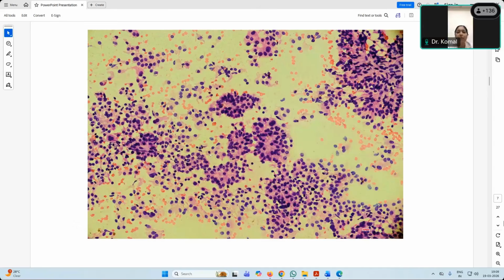Ma'am, I was thinking of papillary thyroid carcinoma. Okay. So do you find those, maybe a little bit of overlapping is there, but did you find other nuclear features to support that? Ma'am, I did not appreciate pale powdery chromatin here, but in some there was some visible nucleoli, as you also said. And also we need to see the nuclear grooving and intranuclear pseudo inclusions. So at this power, at this stage, you know that there are no nuclear features of a papillary thyroid carcinoma. Okay. Yes, ma'am.